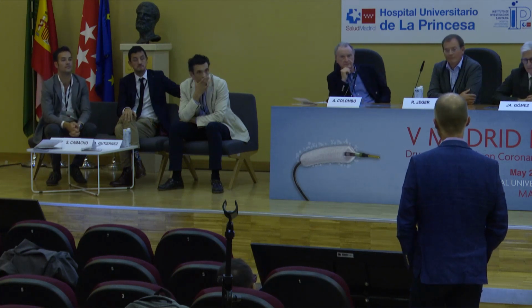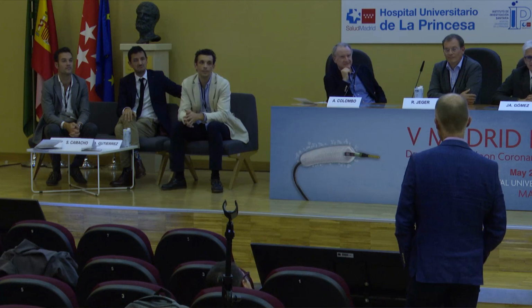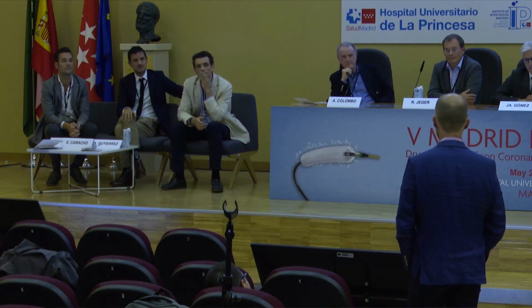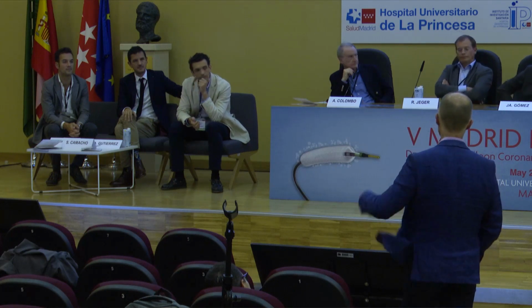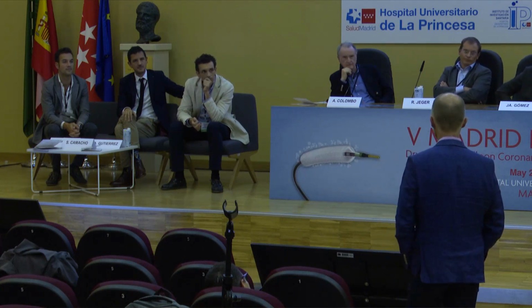No. So I start every angioplasty planning to do an angioplasty, knowing that the vast majority of the time it will end with a DCB, but I have these things called stents on the shelf that will bail me out if it all goes wrong.